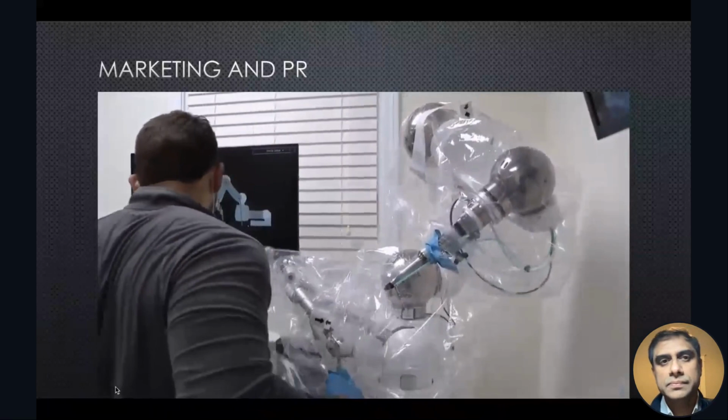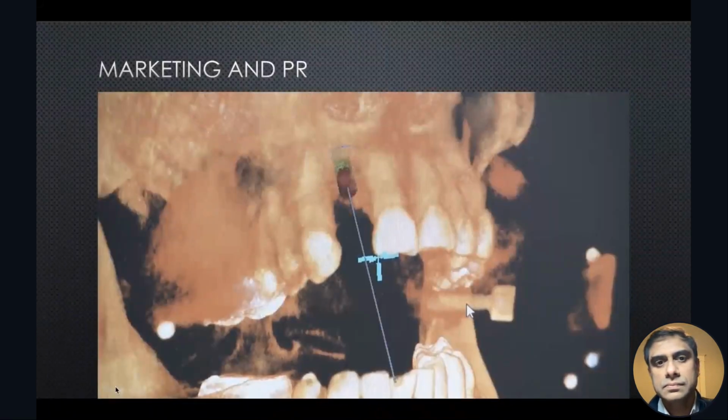Typically, when we did any kind of virtual planning with implant dentistry itself, we would have to have the patient come in multiple times to create as much data as possible.